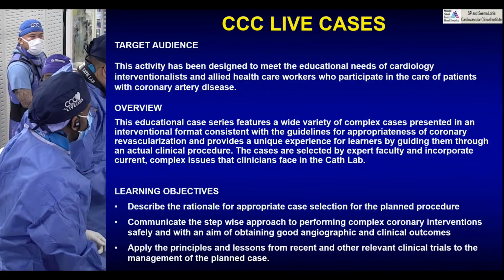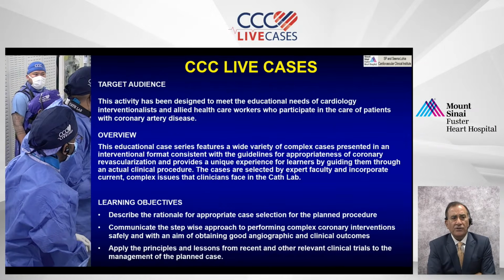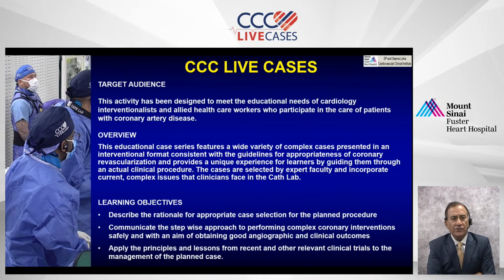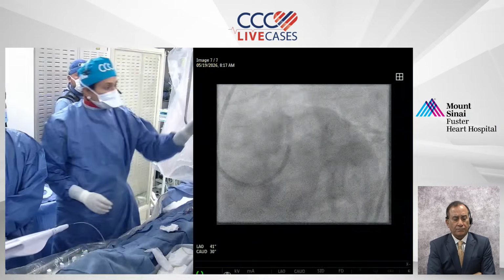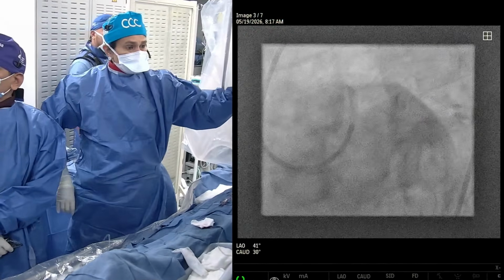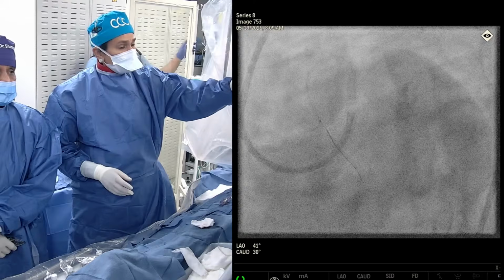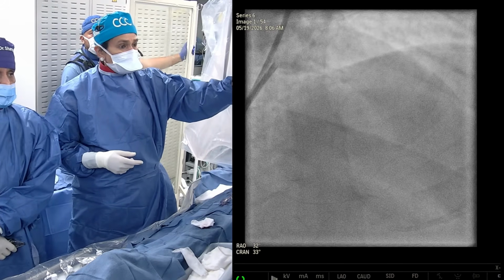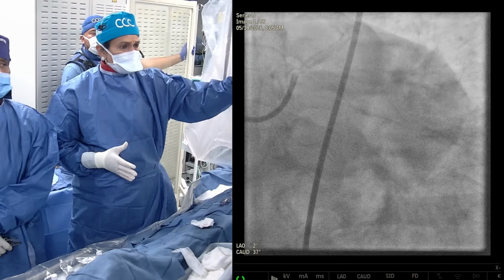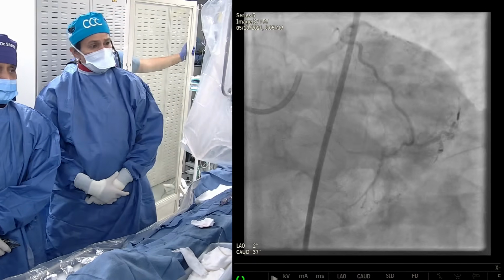Quickly, educate us once. Somewhat short left main. What was your approach towards selecting the guide? Okay, so short left main. We took the FCL guide just because most of the disease from the old picture was all in the LAD. FCL is usually a guide that helps you if you have just LAD disease.